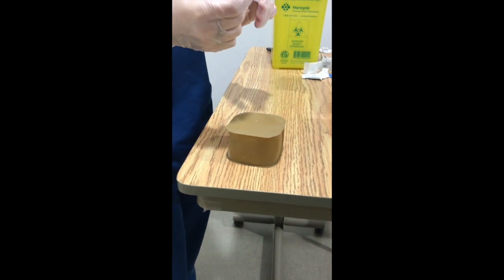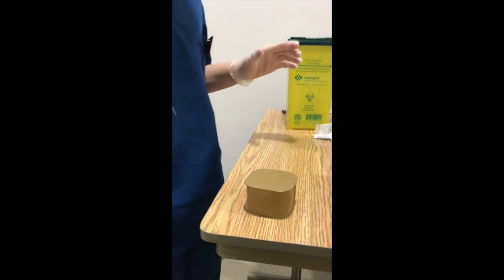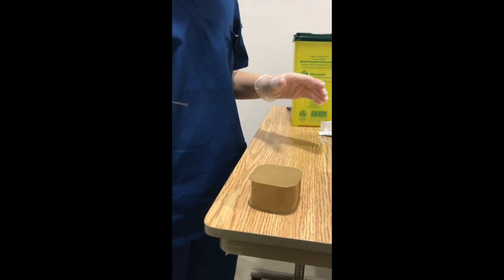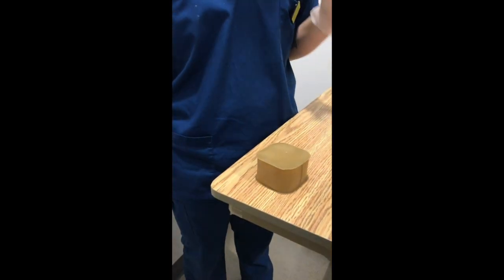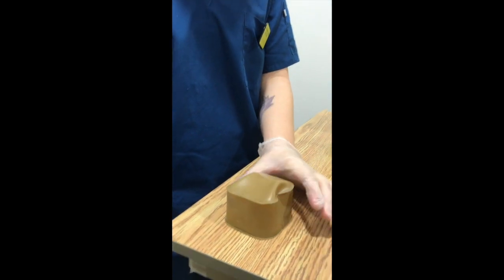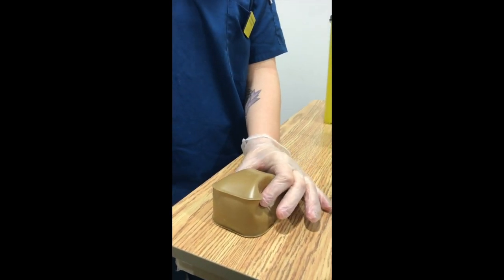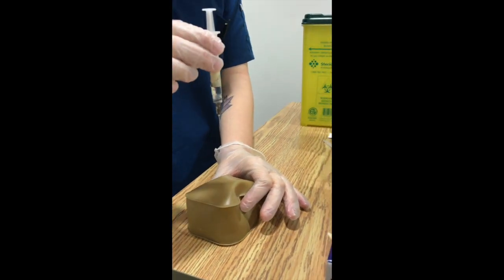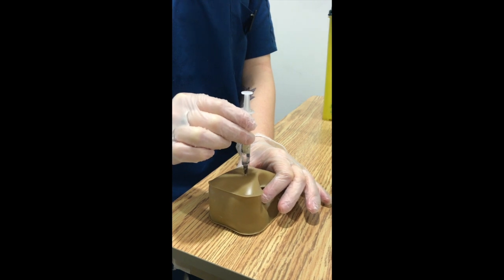So we have the 22 gauge needle. We're going to remove the cap. And then with IM injections, you want to ask your patient to take a couple deep breaths and relax a little bit, because you don't want those muscles to be tensed. So we're going to slightly pinch the skin, not quite as much as with a subcutaneous injection, but just a little bit so that there's a bit of a fold there. And then you're going to go in at a sharp 90-degree angle right into the muscle.